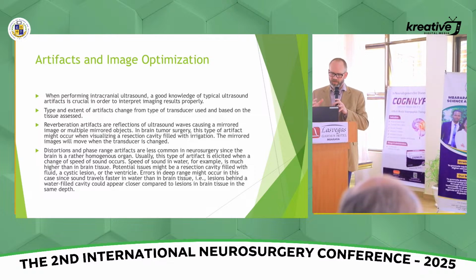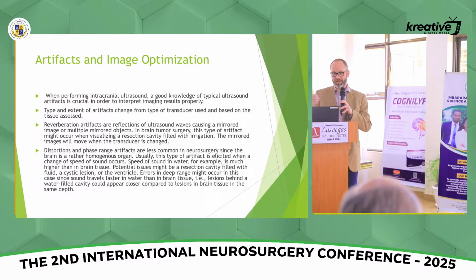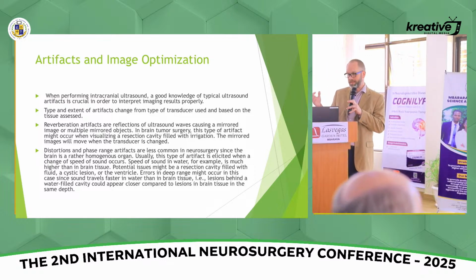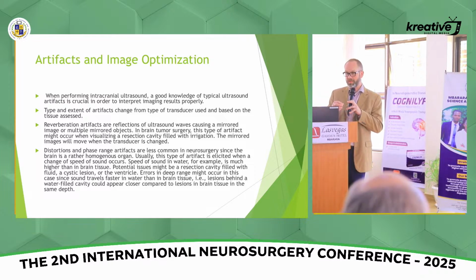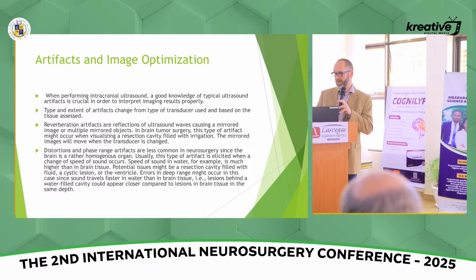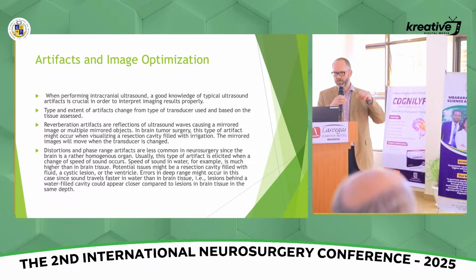I find if you suddenly see the brain swelling around you at surgery and you don't know quite what's going on, ultrasound's very helpful. You pull it right over, you look, you can see a big hematoma if there's a hemorrhage, you can see hydrocephalus developing, right? And then you can even pass a catheter into the ventricle of the brain to be able to drain that ventricle if necessary, especially because at surgery you're often in kind of a strange position to use anatomy to find your ventricle. So instead you can see it on ultrasound.